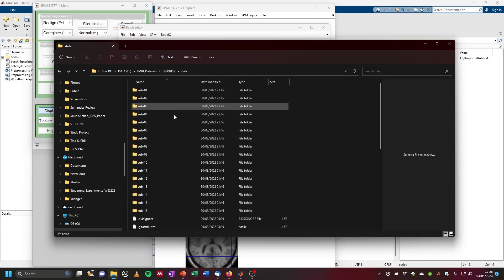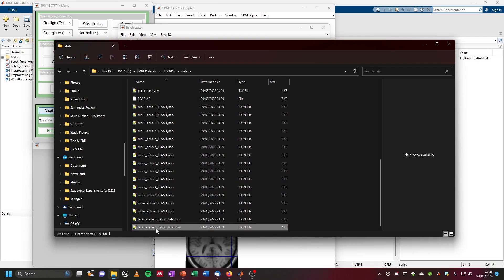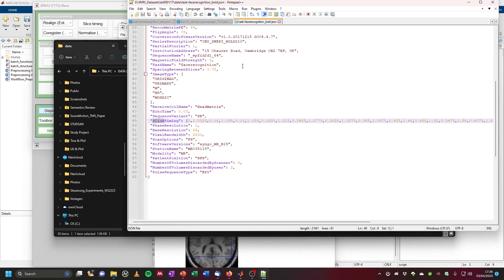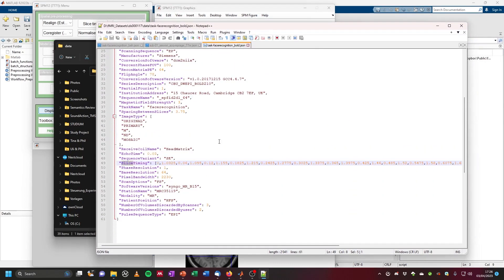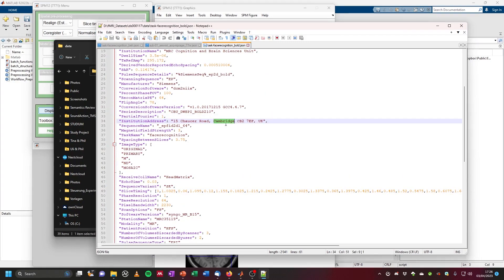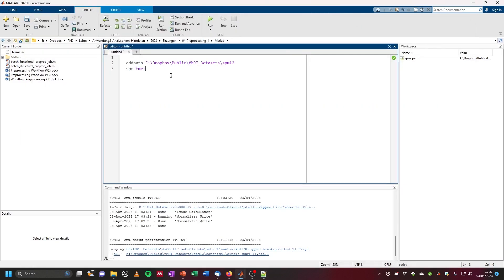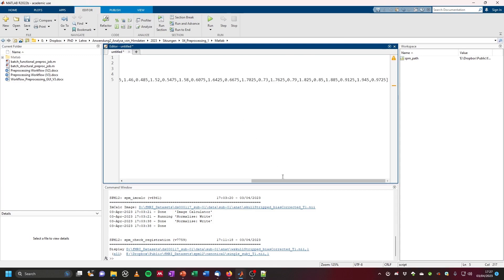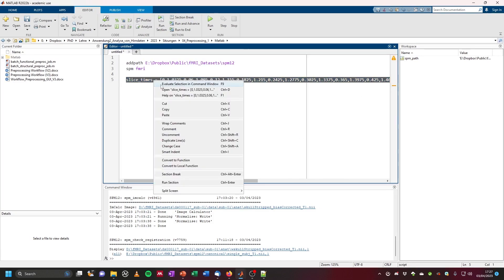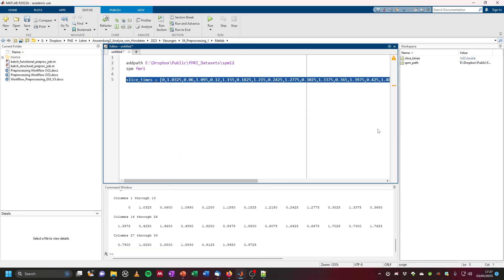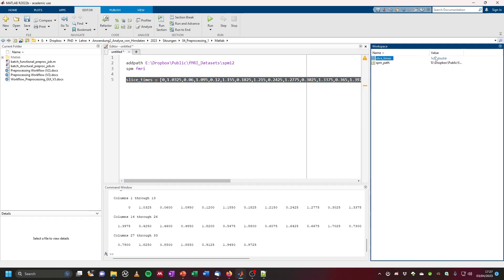Typically you will find this when you go to your dataset. Search for a JSON file ending with 'bold.json' — this is the associated JSON file for your BOLD images. Double-click on this and you will see all kinds of information, for example where the scan was acquired (in this case Cambridge), and also often you will have slice timing information. This vector of slice times gives the acquisition time of each slice. Copy this, put it into a vector called 'slice_times', and when executed it shows a 33-element vector.